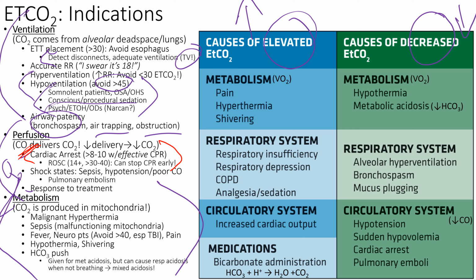Okay, and then once you get ROSC, once your heart starts beating, right? Because CPR is not very effective. We try our best to compress through the sternum and everything to get perfusion, but once your heart starts beating, it's really going to boost up the flow, right? And you're going to see that boost. You're going to see about 14 points of boost, right? So you get an end tidal CO2 during CPR of 8, and you get 14 points, 22.